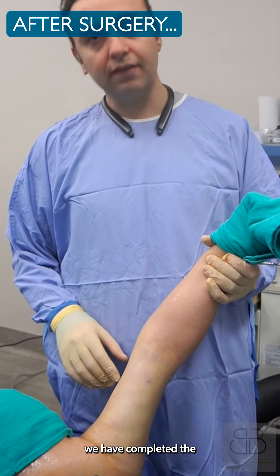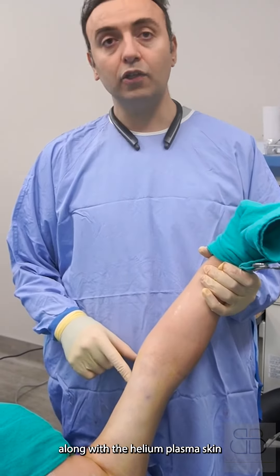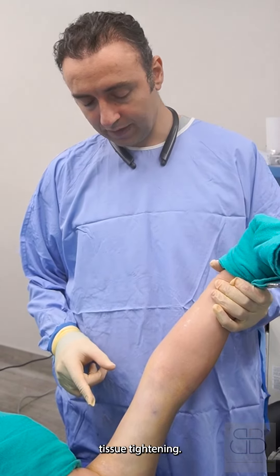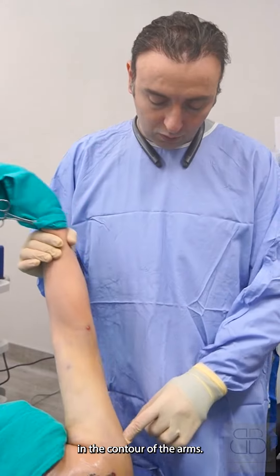Right now we have completed the liposuction 360 of the arm, along with the helium plasma skin coagulation and soft tissue tightening. You can see a better improvement in the contour of the arms.